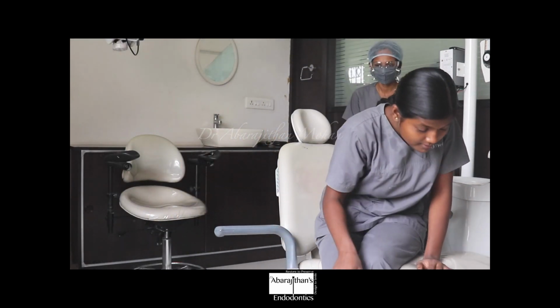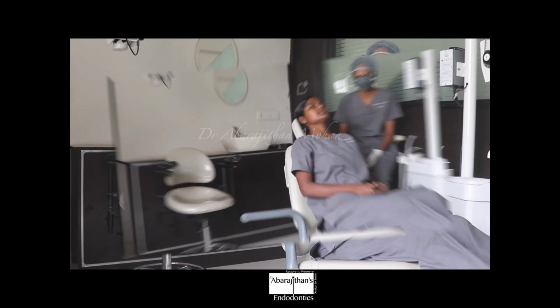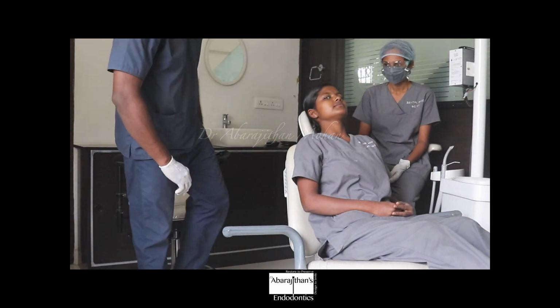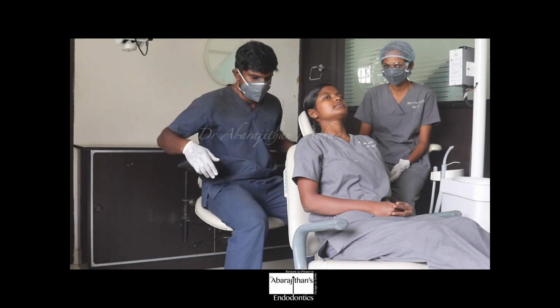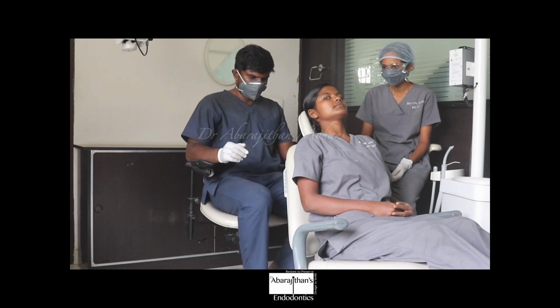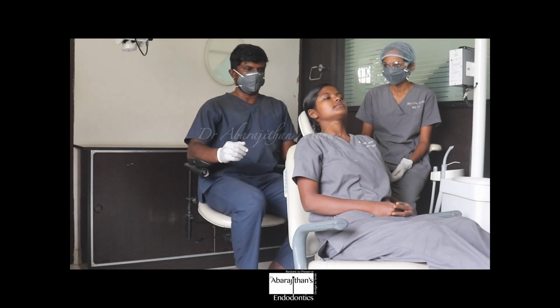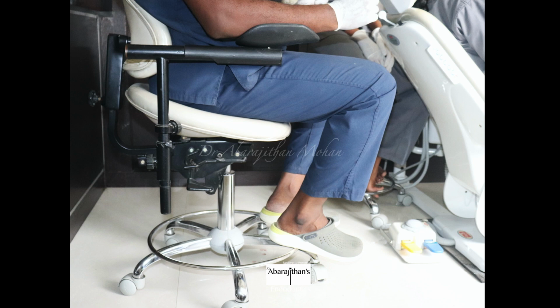And now the patient comes, gets seated, following which the operator arrives, closes the armrest, and the first step here is the operator needs to get himself seated comfortably before adjusting the patient. So what we need to do is the operator needs to make sure the basics of ergonomics are right.